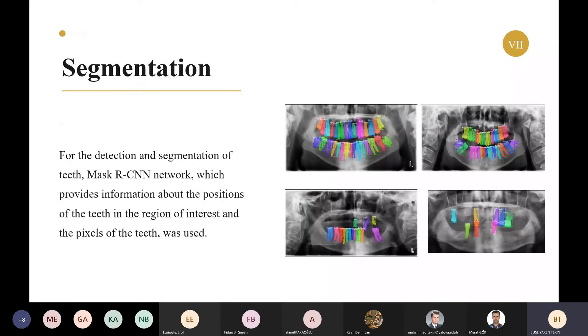In the neural network, the ResNet-101 FPN feature pyramid network model is used as the backbone network. Transfer learning is provided with pre-trained MS COCO weights and further detection and segmentation of teeth with Mask R-CNN, which provides information about the positions of the object in the region of interest and the pixels of the teeth.